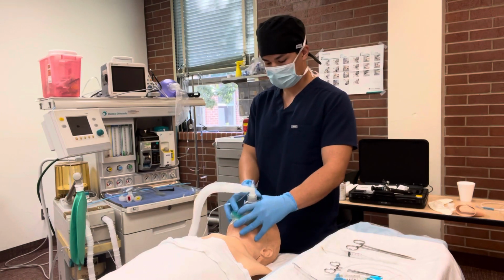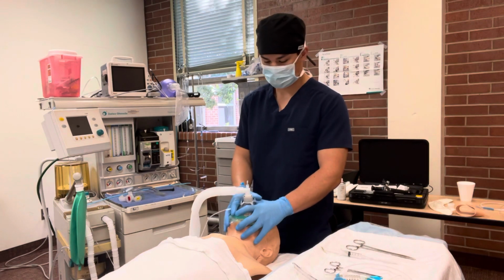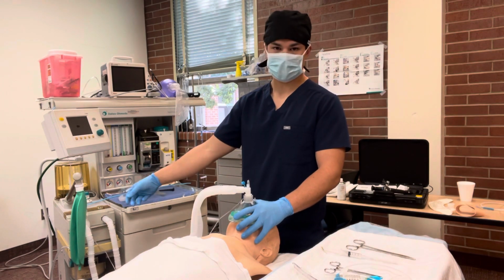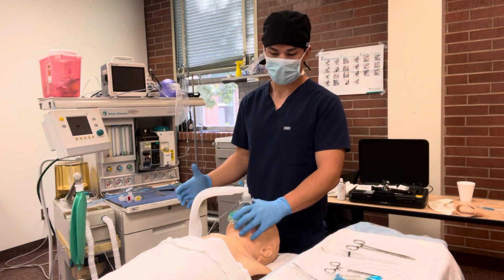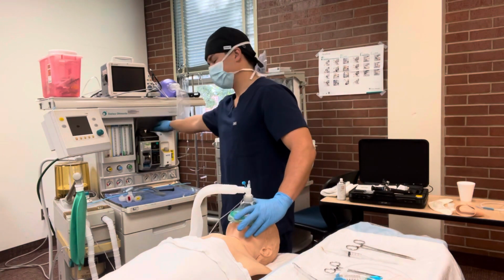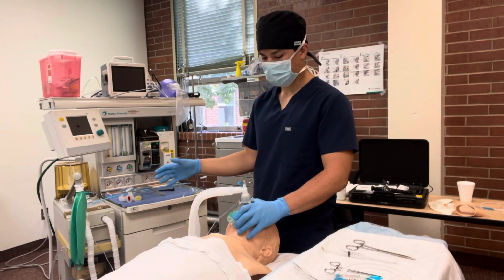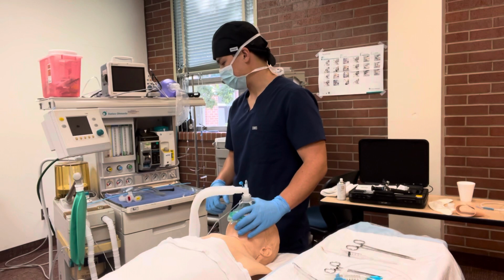What if I can mask ventilate my patient and I'm not able to yet intubate my patient? I got myself some time. I'm just mask ventilating. Everything's good. I'm pre-oxygenating them. I can think about waking them up, or I can deepen their anesthesia. So I'm just going to turn up my gas, deepen them. I'm gonna make a plan, set myself up for success here.